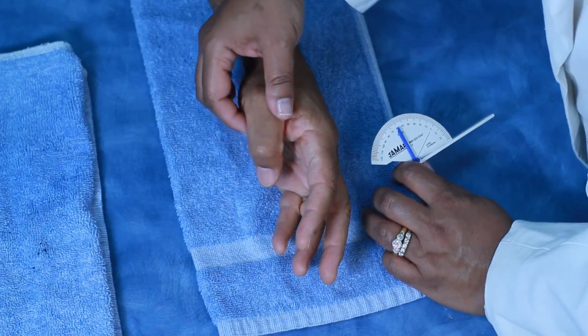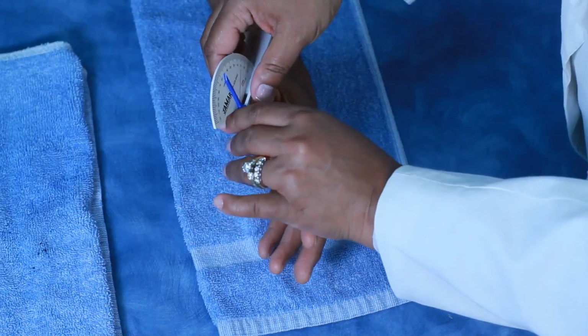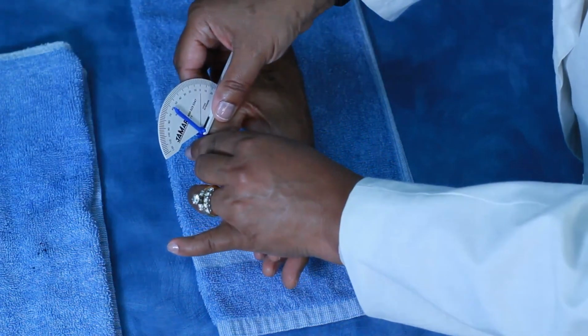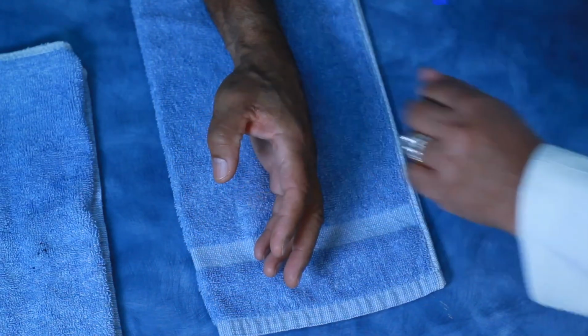I ask him to relax this position and bend just the tip, and he is getting to 60 degrees. And I'll turn it slightly so that you can see the number there at 60. And that takes care of the thumb.